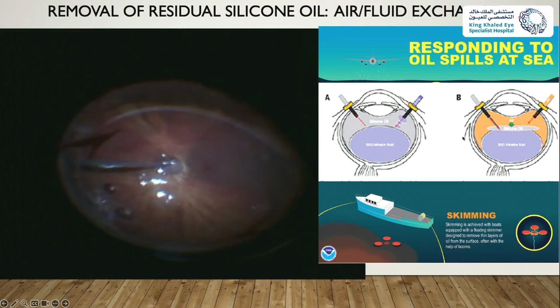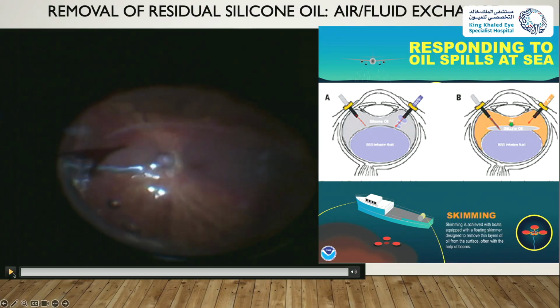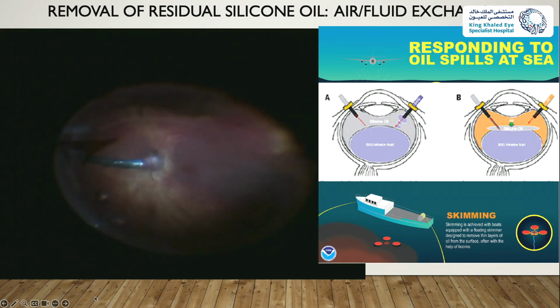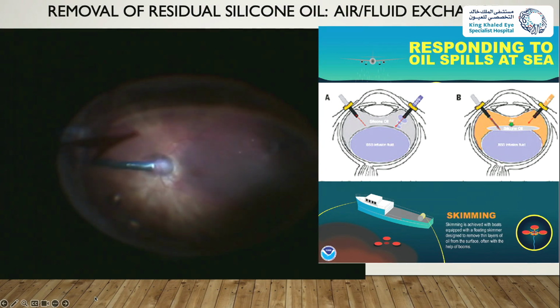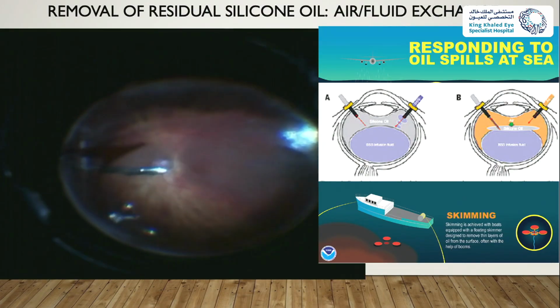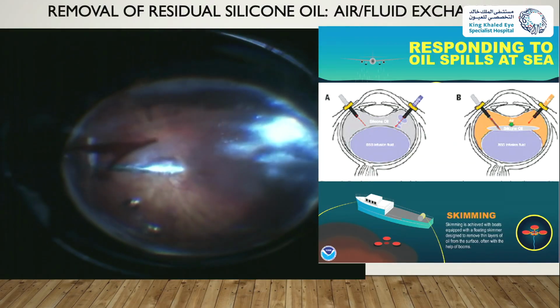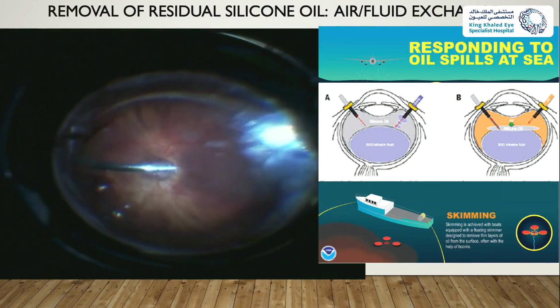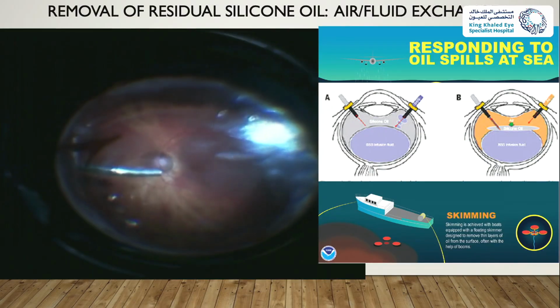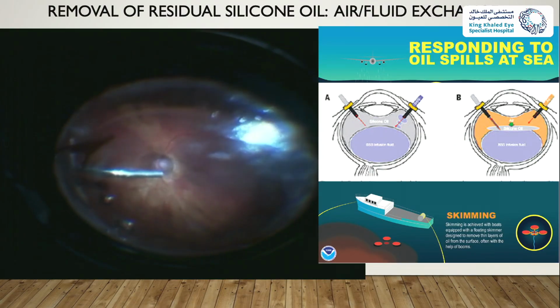So if you put your cannula inside the fluid, what you're doing then is you're actually aspirating only the fluid. So you see, when I touch the interface, there's fluid. And so I'm aspirating the surface of the fluid, which is the oil float. Again, I've stopped, I'll touch the interface, and that's where the oil is. Then I aspirate very full aspiration, and then the water would drop.